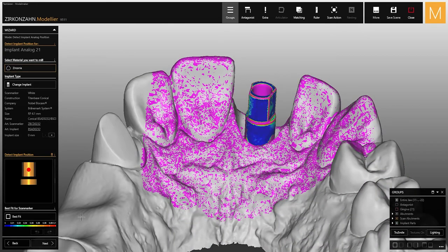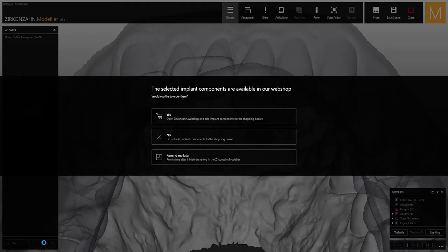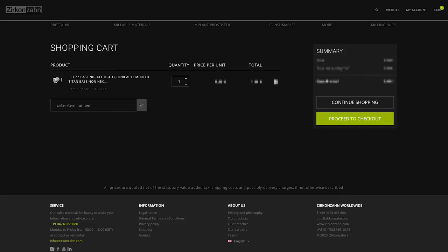If you then click on Next in the wizard, a new window opens and by selecting Yes, you can directly add the selected components to the shopping cart of your Zirkonzahn webshop. There, the required articles can be ordered automatically without entering any code, since it is already associated with the specific patient case.